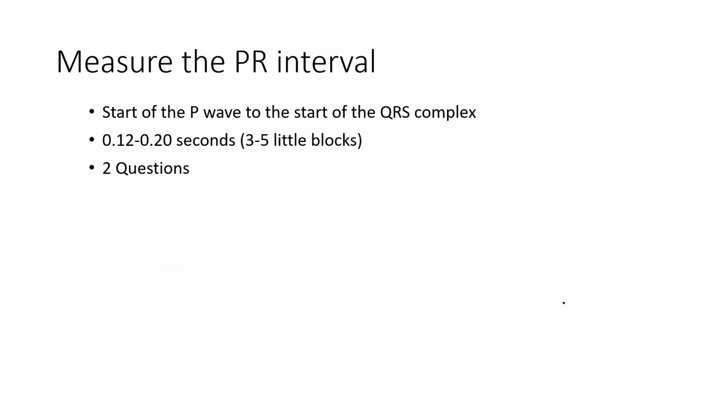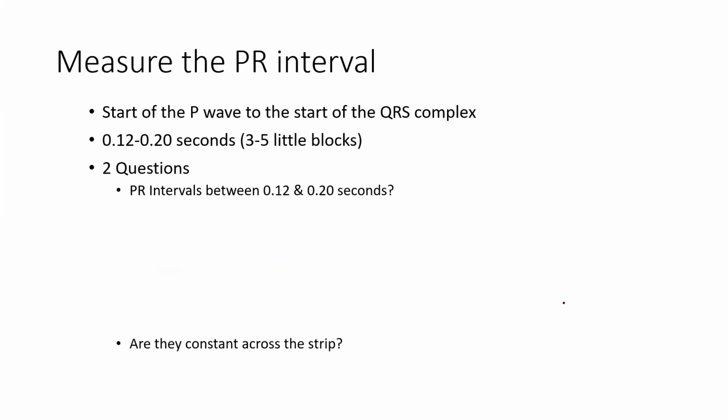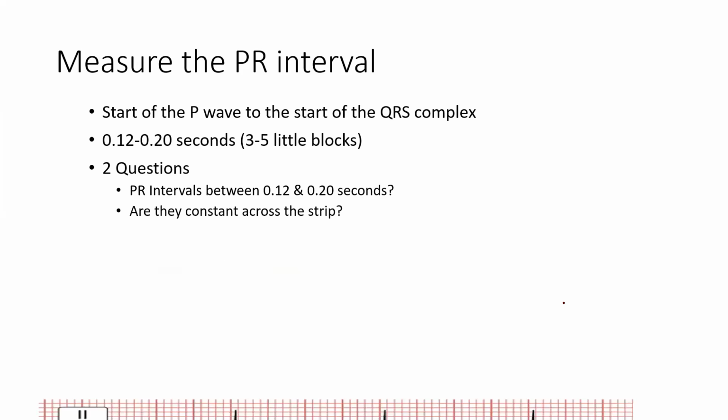There are two questions that you have to ask yourself about the PR. Number one, is it between this time frame? Is this time frame correct? Is this how long that PR interval is? And is it consistent across the strip?